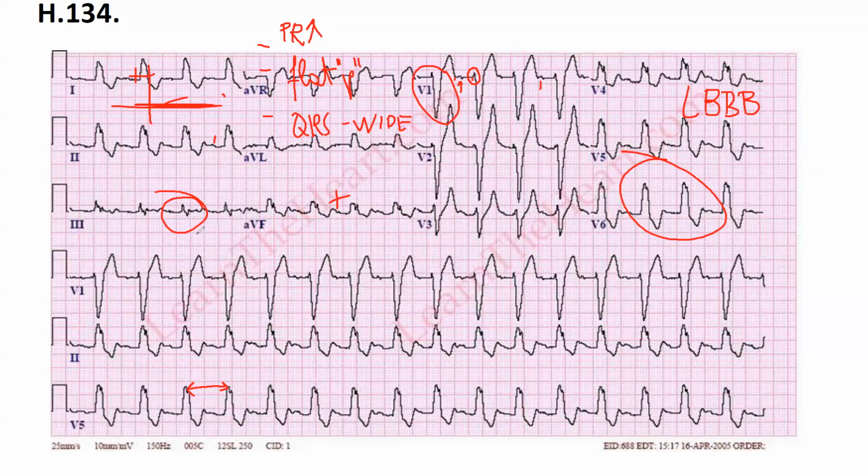ST-T. The large one is a T wave. You do have a prominent T wave.